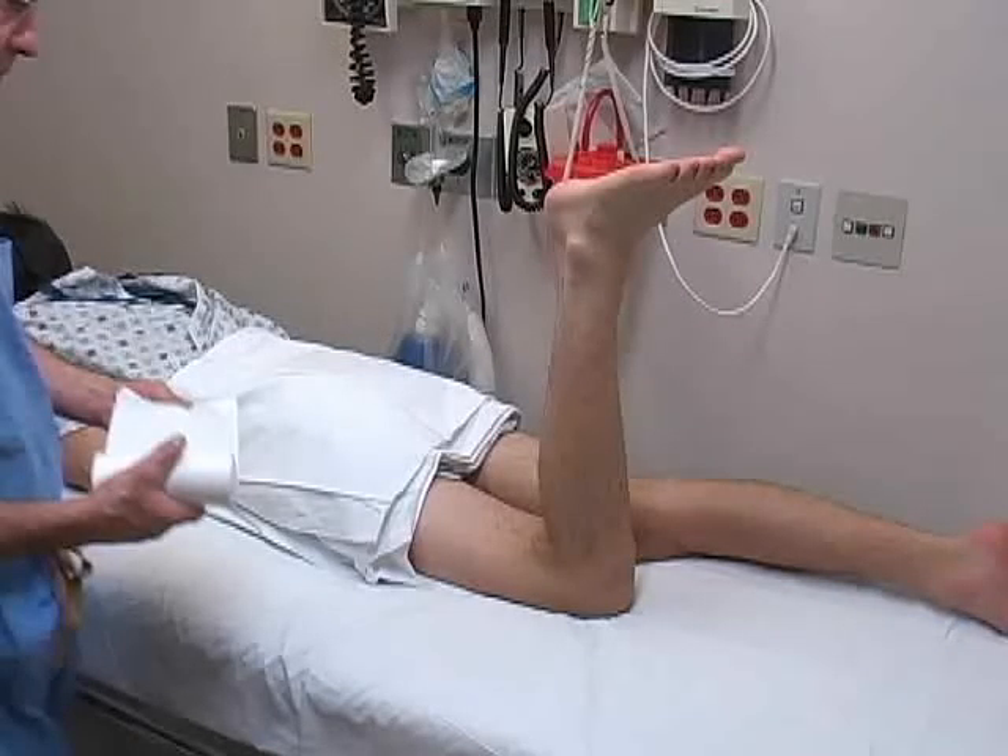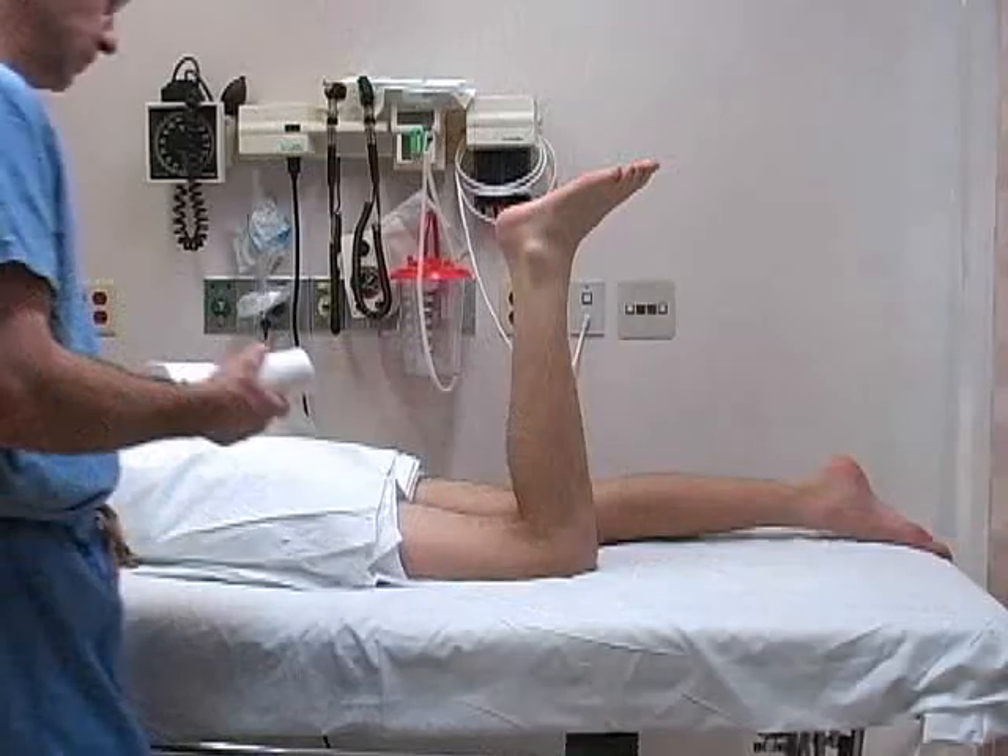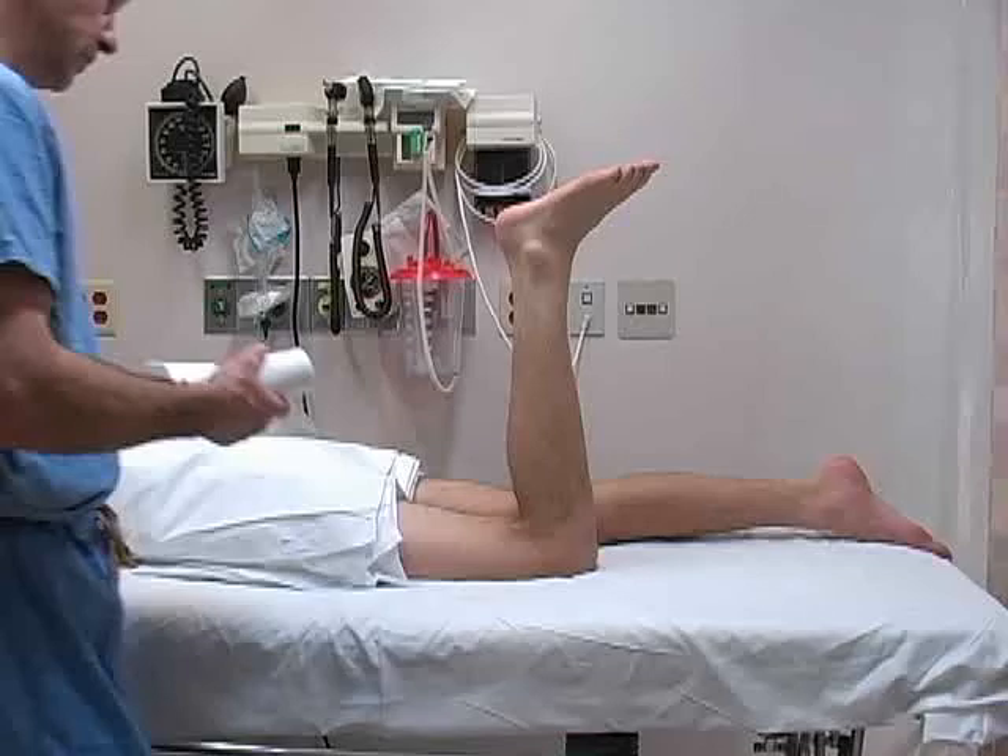Place the patient prone on the stretcher with the knee and ankle flexed to 90 degrees so that the lower leg is perpendicular to the plane of the floor.